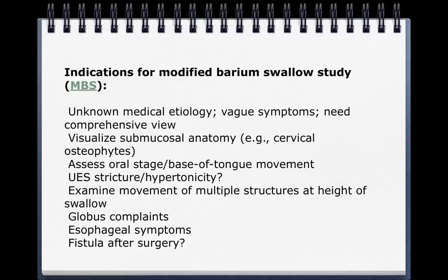That would be the MBS. And I should say this comparison presupposes that you would have access to both of these technologies in your setting. Obviously, if you only have one, that's the one you're going to use. But many facilities have access to more than one, both of these, and maybe more. So this is a discussion of the relative benefits or merits of each of these kinds of procedures.